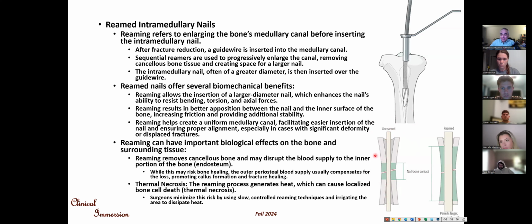So in this specific patient, external and internal blood supply will be damaged, and the tibia or femur will die. So if we have a severe trauma to the limb, we do not use reaming. We use unreamed nails. We know that they are not perfect for fixation, but saving the patient's bone and life and limb is more important than performing a biomechanically sound fixation. We must balance everything.